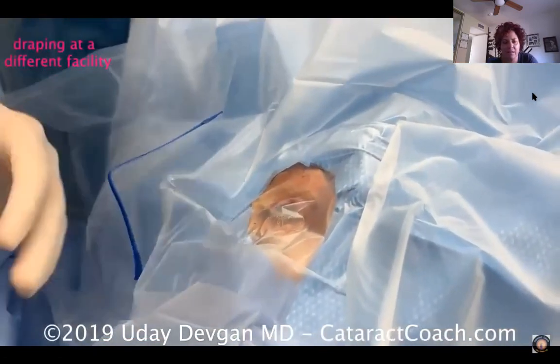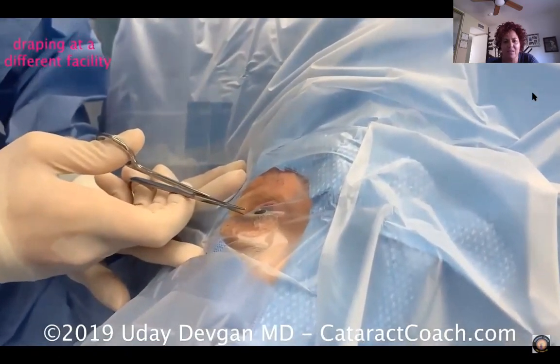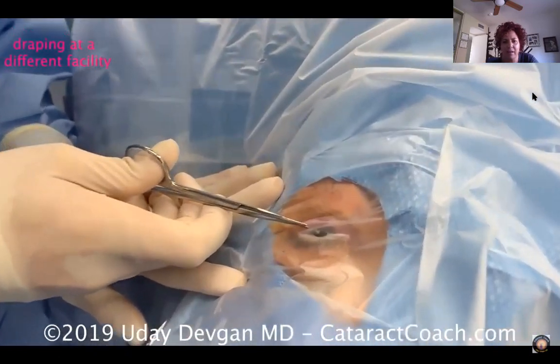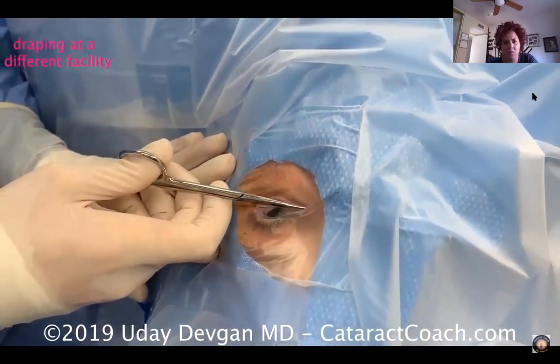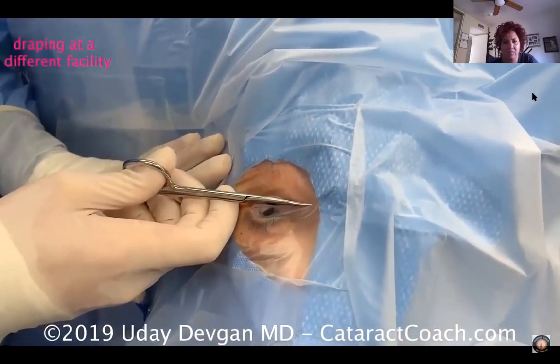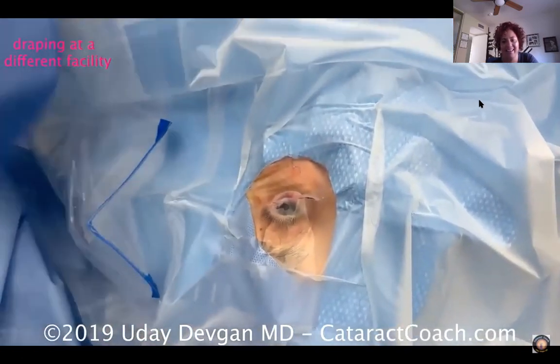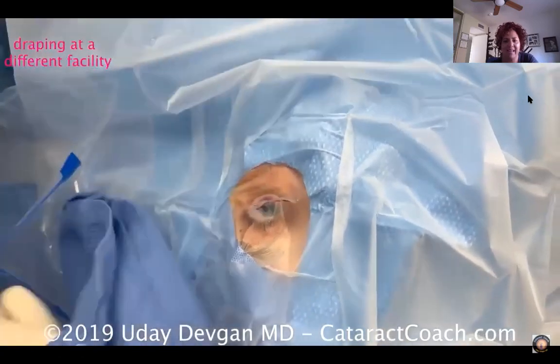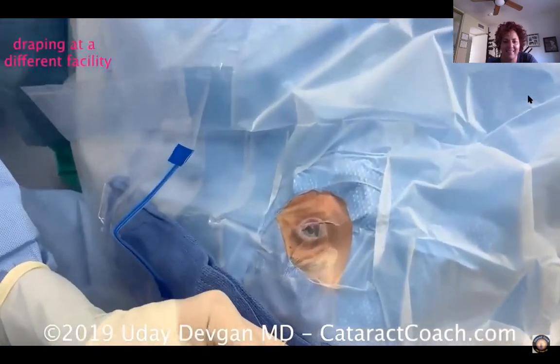And this is perfectly acceptable also. Now the question is, how obsessive are you about not touching the skin? It's prepped with the betadine solution. It is sterile. Certainly when you operate on any other part of the body, the skin is being prepped in the same way and it's considered sterile. And so now he's incising the drape right down the middle, putting a little extra towel here to absorb any fluids during the procedure.